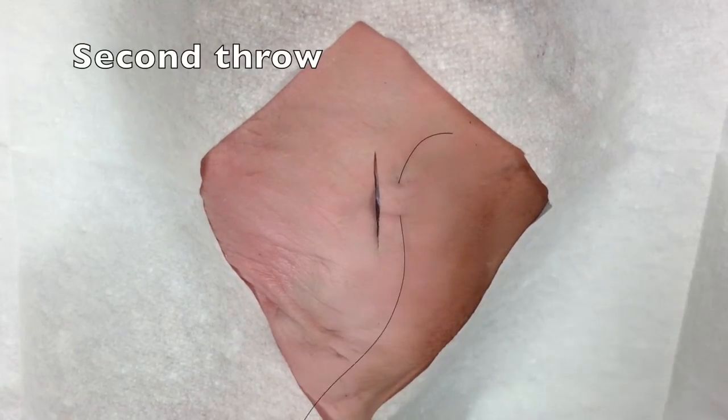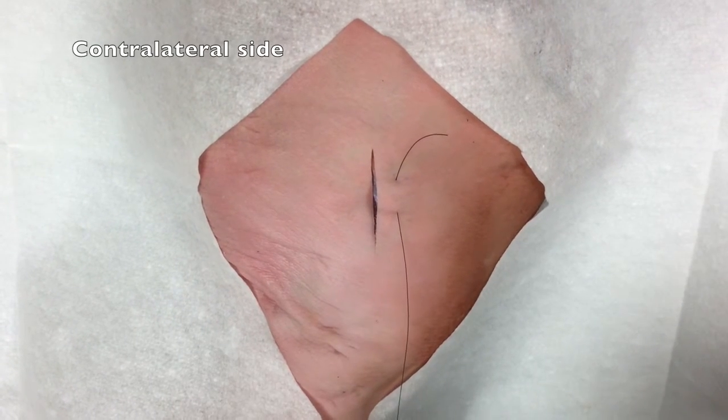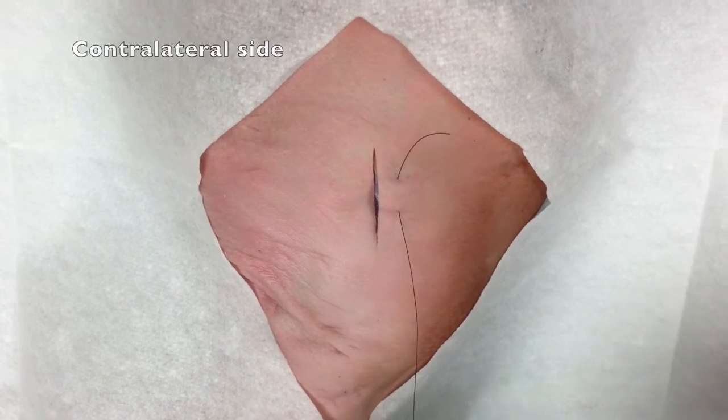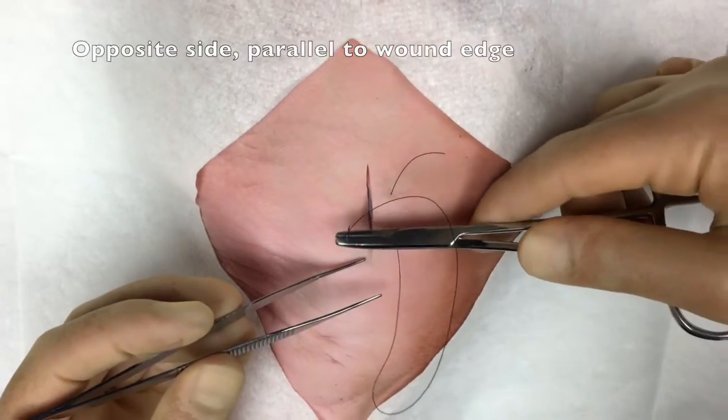The second throw will occur on the contralateral side of the wound, placing the suture through the epidermis equidistant from the exit point of the suture on the initial side of the wound.